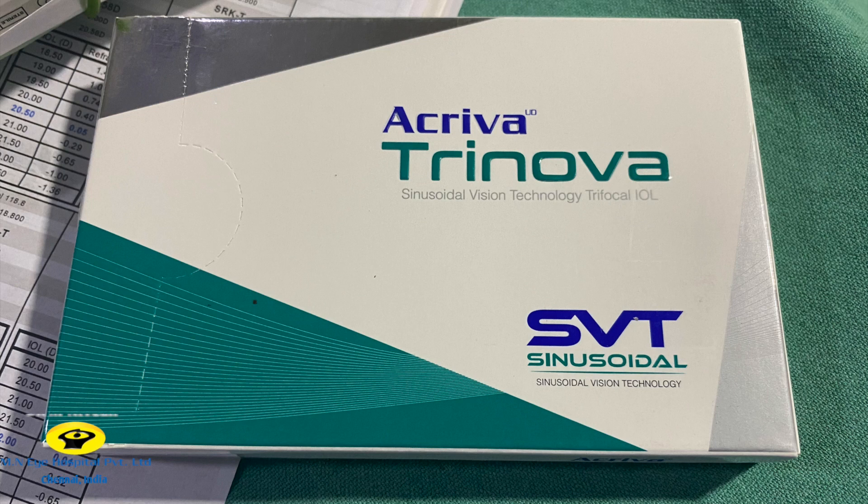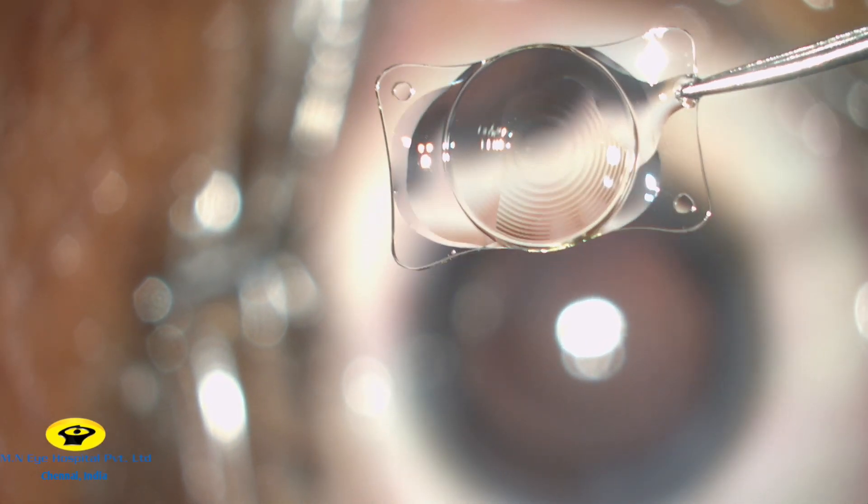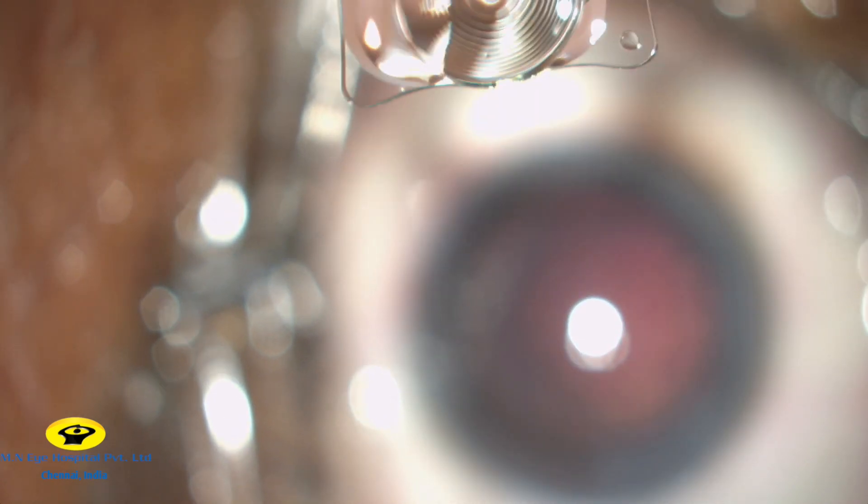This is the all-new Acriva Trinova Trifocal IOL with 12 unique ridges which enables the highest light transmission of 92%, providing excellent visual outcomes in mesopic conditions with higher contrast sensitivity.